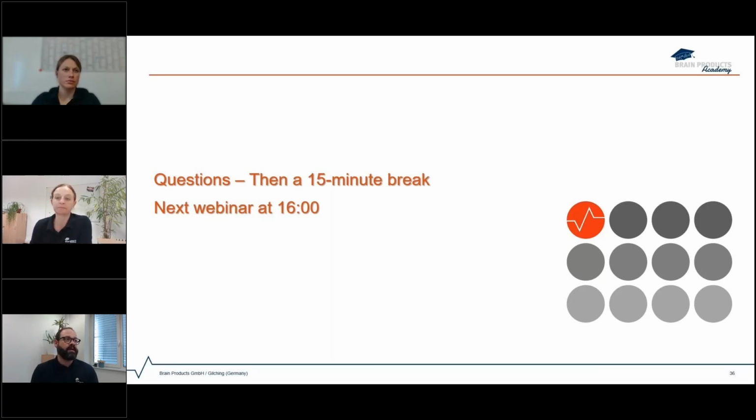But I would specifically say in this pipeline that we showed, stuff like changing the channel layout or the markers, these are things you usually do in the beginning, but we could have done them later. That would be fine. While, for instance, the ocular correction ICA, it is really profiting from having nicely filtered data, from having big artifacts marked as bad intervals. So it should not come at an earlier point, actually. If we now take the filter and the new referencing and swap them around, that, for instance, might not make such a big difference.